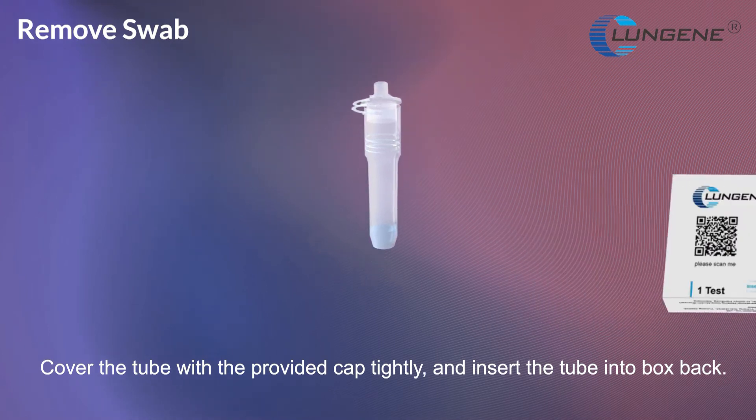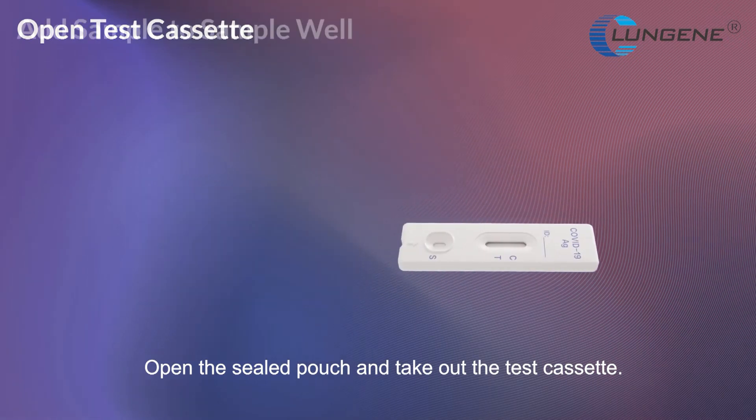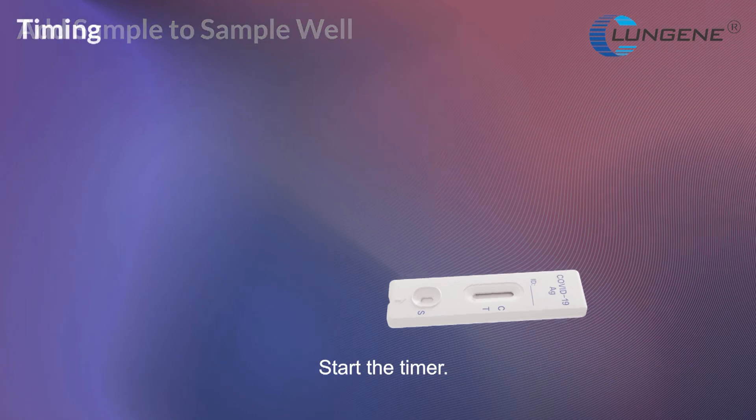Cover the tube with the provided cap tightly and insert the tube into the box back. Open the sealed pouch and take out the test cassette. Hold the tube vertically over the sample well, not at an angle. Add 3 drops into the sample well by gently squeezing the sides of the tube, then start the timer.